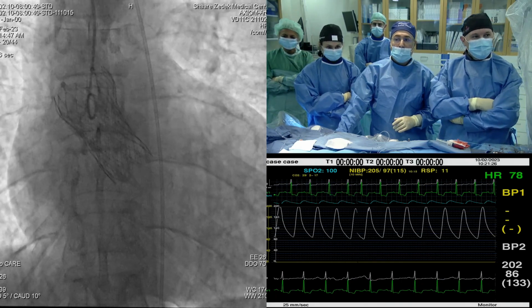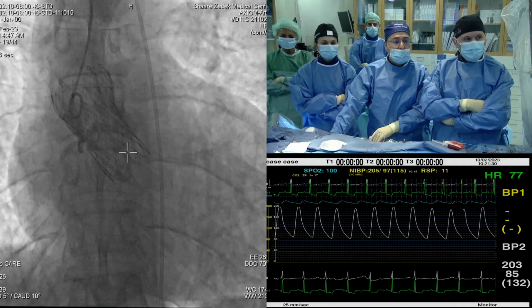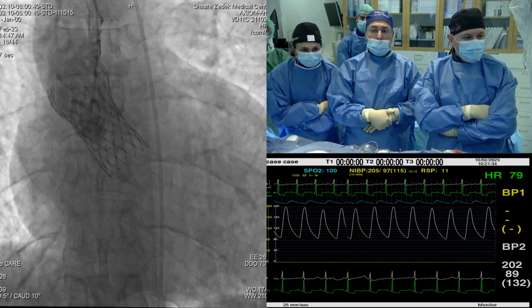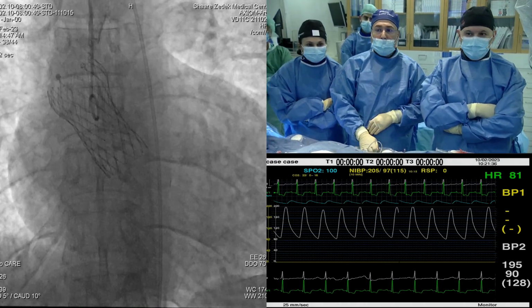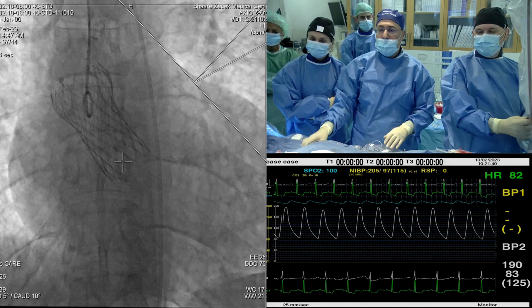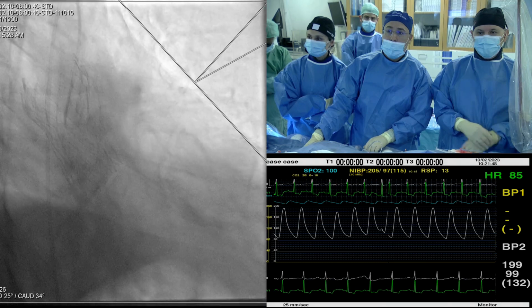No, the hemodynamics are wonderful. There is no leak, coronaries do flow, so it appears that this was the right decision. Indeed, it appears that it did sink down about 2 millimeters, but it doesn't really affect the hemodynamics. Caudal just for our interest.